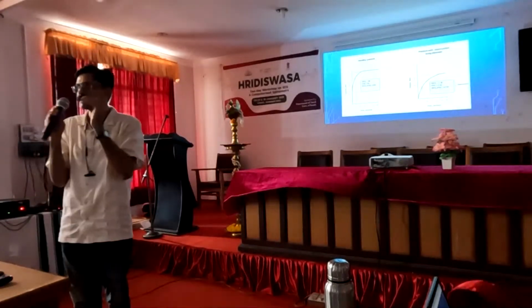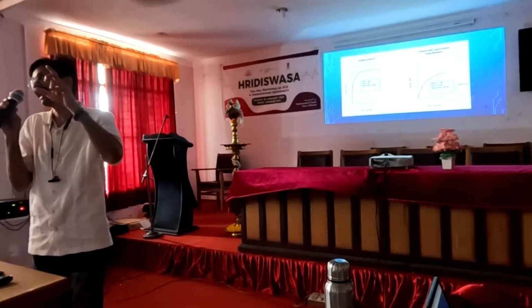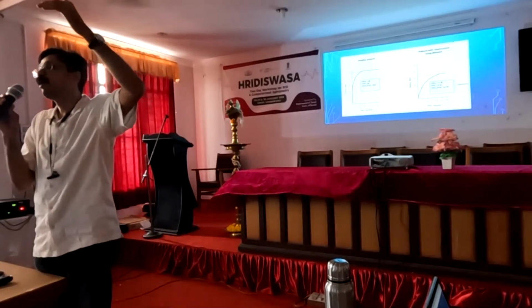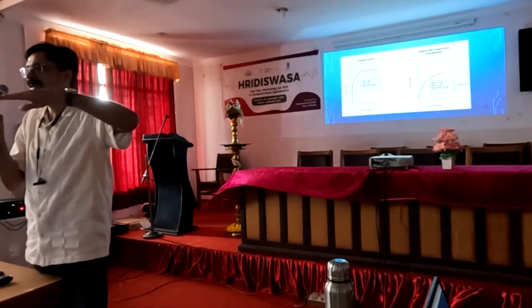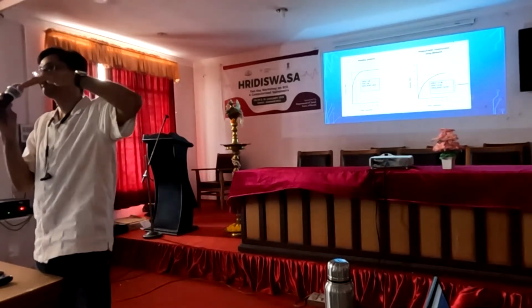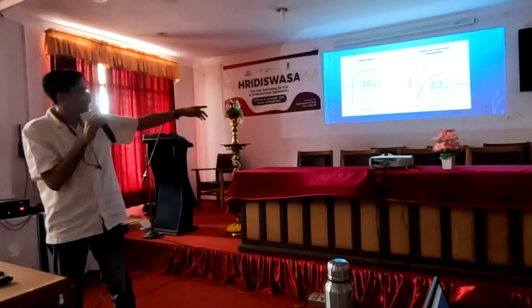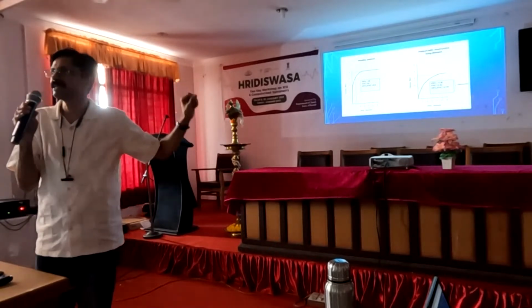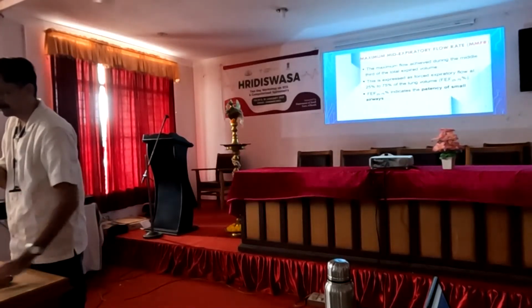So in restrictive disease, what is happening is there is a problem at the time of inspiration, so all the volumes will be decreased. Clear? Tidal volume of 500 ml will be there, but inspiratory reserve volume decreases. Expiratory reserve volume may have a corresponding decrease. Clear? Here it is 56%, so the FEV1 percentage is 56, so it is an obstructive lung disease. That is the difference.